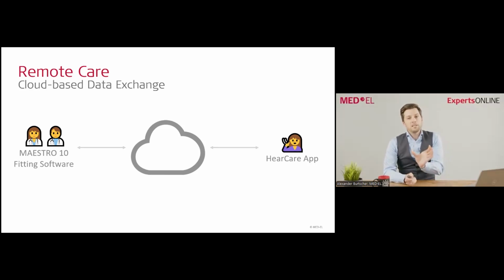So you see, there's no need to really, as I mentioned before, schedule an appointment, to be online at the same time, to perform such routine tasks or fine-tuning tasks. This can really happen very much independently from each other. Also empowering the recipient with the app to look after their own system, as we will see, to get troubleshooting advice for whatever the issue may be. So to really save them a trip to the clinic, and also to save the clinician time by not having to really schedule this appointment for, say, a full hour where it can only be managed in a few minutes.